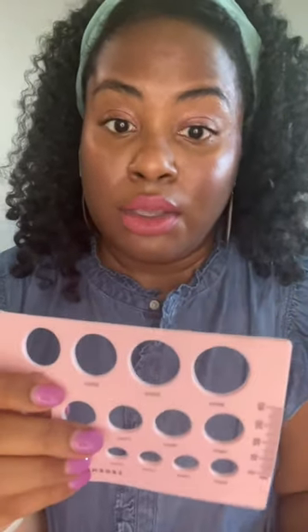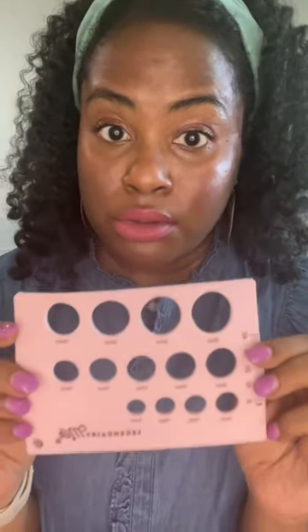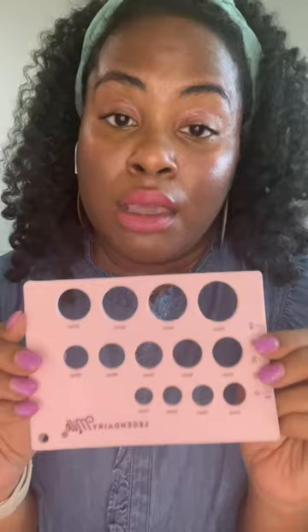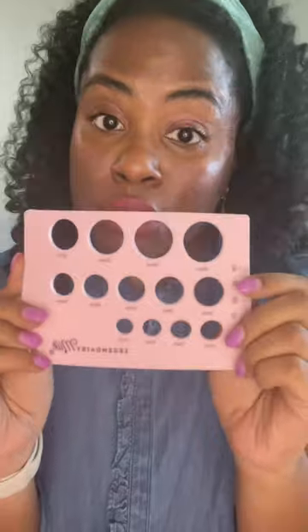Today I'm using this milk ruler by Legendary Milk. However, there are other tools available to you — I bought this from their website, but you can also find it on Amazon, or get something similar from your local craft store like Joanne's or Michael's. They have circumference rulers you can use just like this. If you have any questions, let me know below.